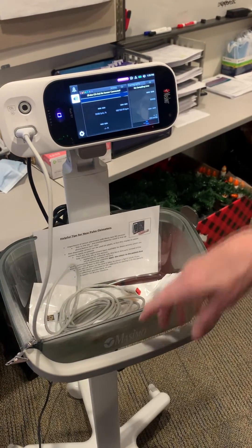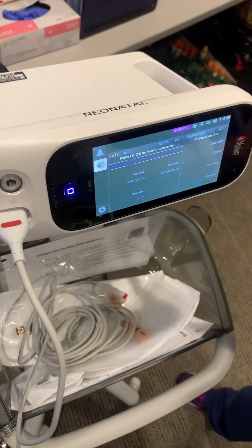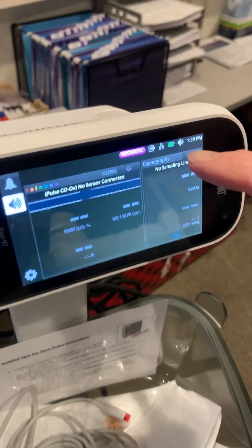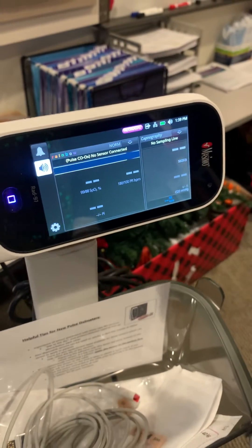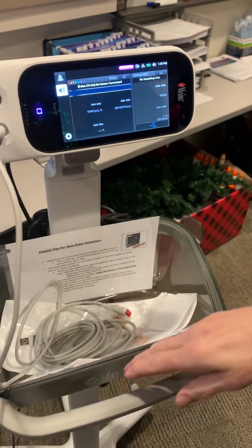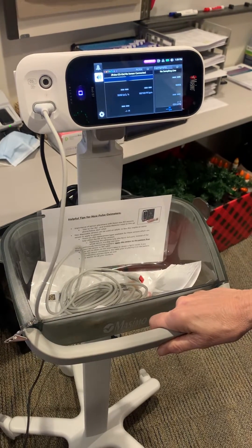This is our new pulse oximeter. You'll see on the top that it's labeled neonatal — it's also purple, saying neonatal right here. We have seven of them that say neonatal, and they all are on these rolling stands. So they're all in the second nursery.